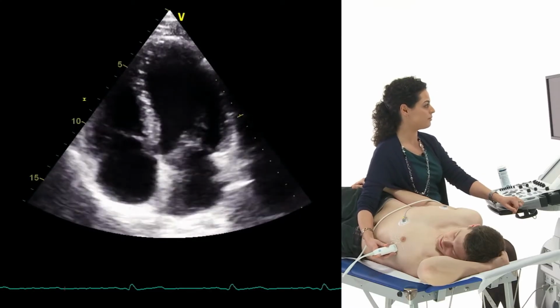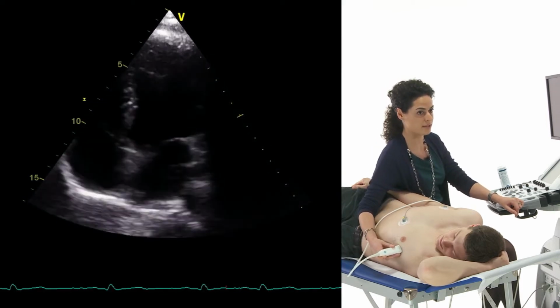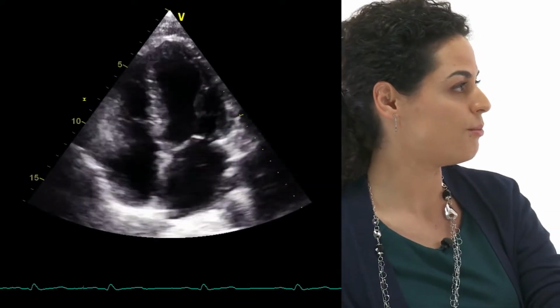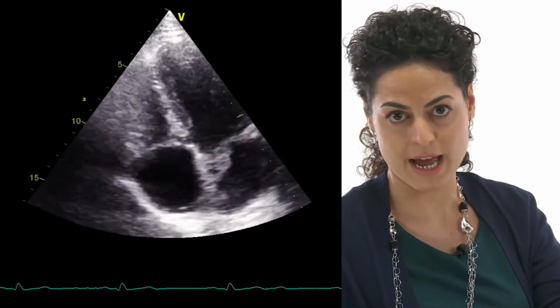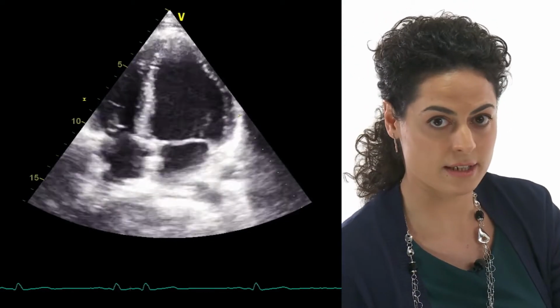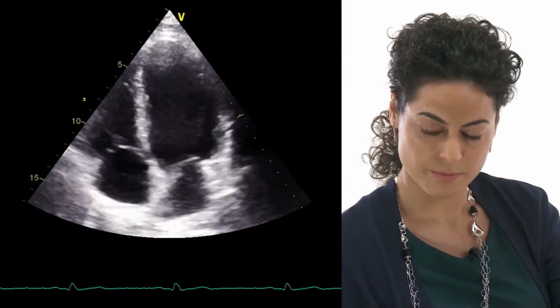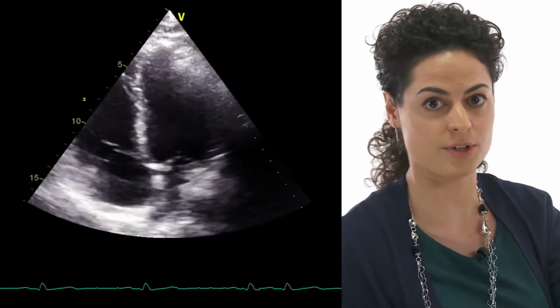And now I will teach you really in a simple way how to move the transducer to optimize your image or to get new views. So to optimize your image, I would recommend you to move the transducer in 3 ways. So what you can do is move the transducer from lateral to medial and back. You can go more cranial and caudal. You can do slight rotations, and this you will understand is mainly for the right ventricle.